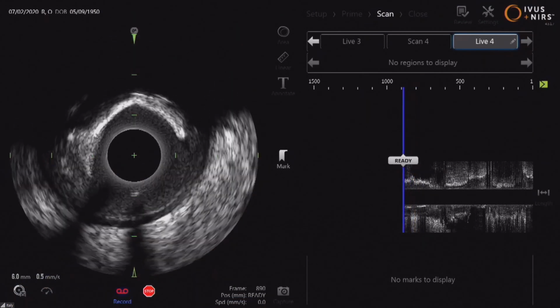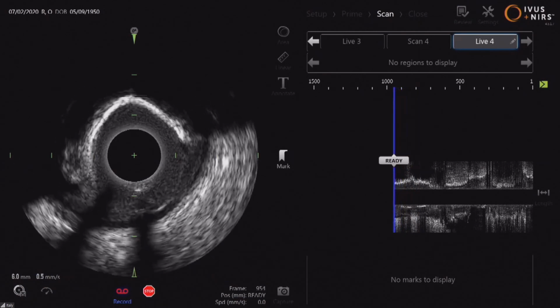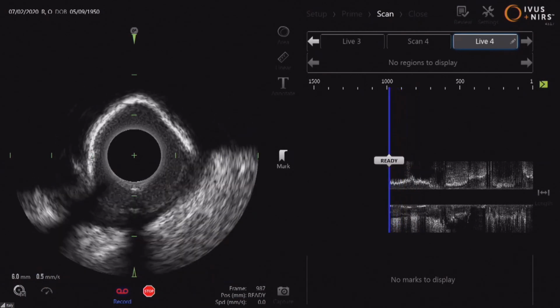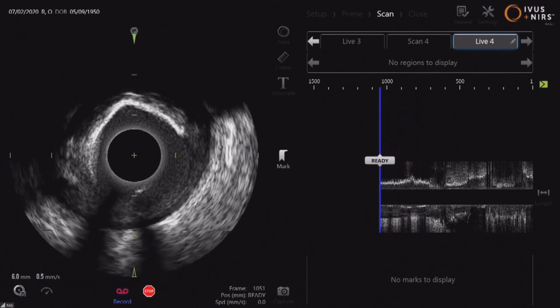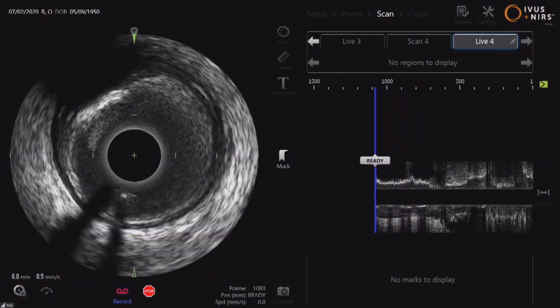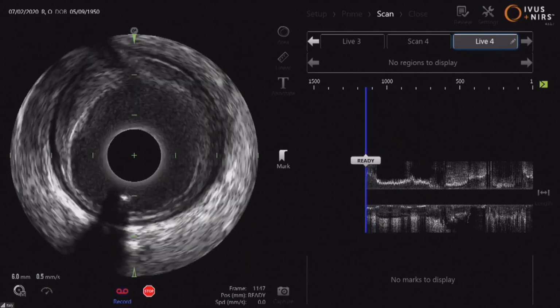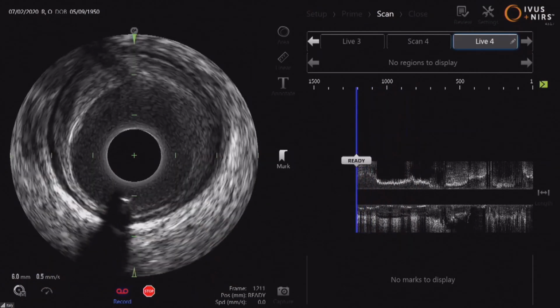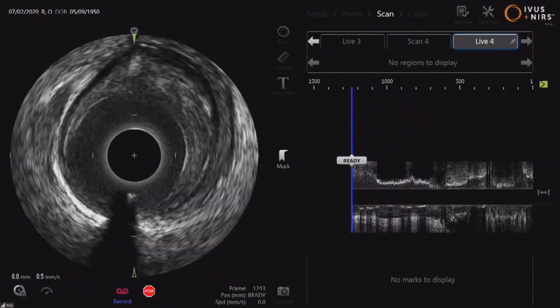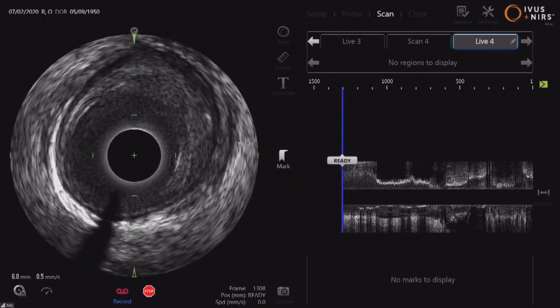If you measure, here is the lesion. You see it very well with more than 180 degrees of calcium. And here, proximal to the lesion, is a big vessel, definitely 3.0. And here is the proximal circumflex, with some plaque, is 3.5.